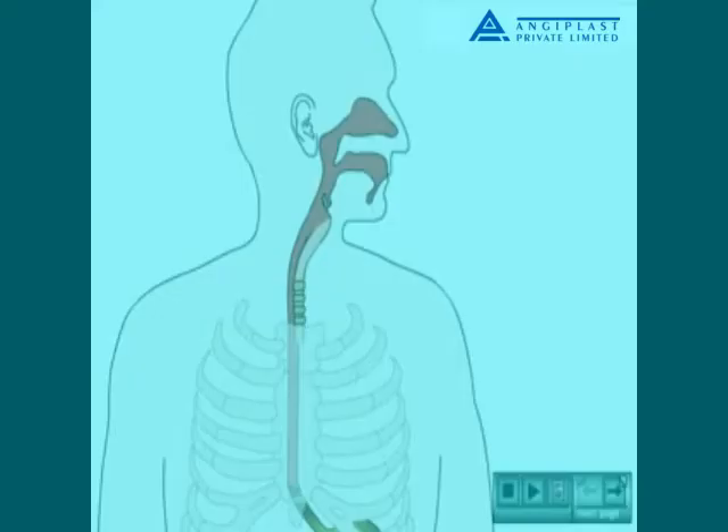The NG tube is measured against the person to determine the approximate length to be inserted, by measuring the tube from the tip of the person's nose to their earlobe, and from there to the xiphoid process of the sternum.